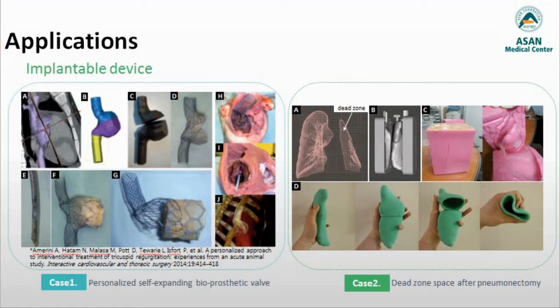In the near future, the final implantable device could be manufactured with a medical-grade silicone material through an additional molding process and evaluated in a prospective clinical trial.